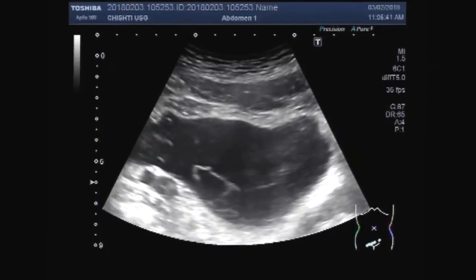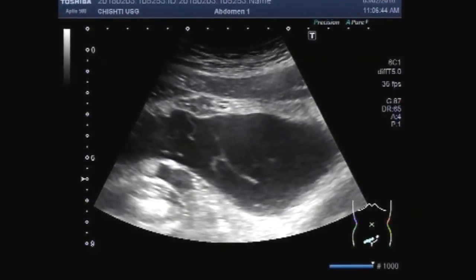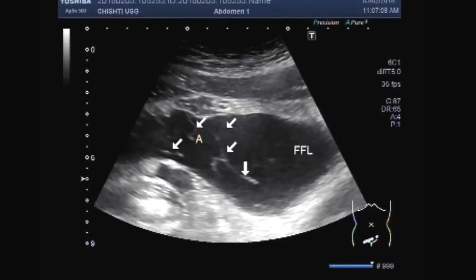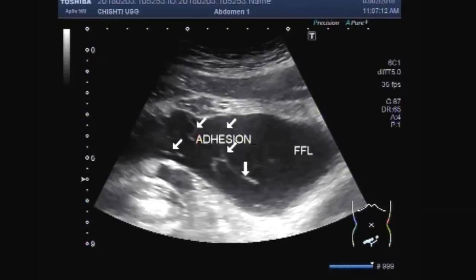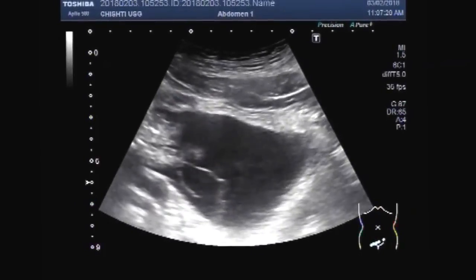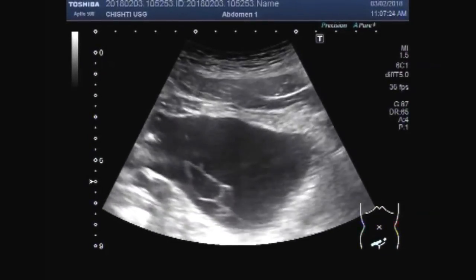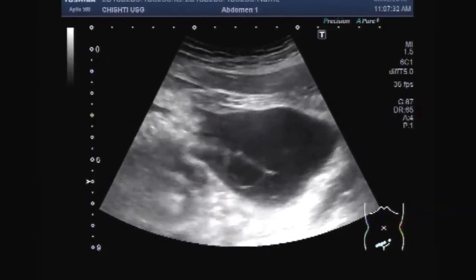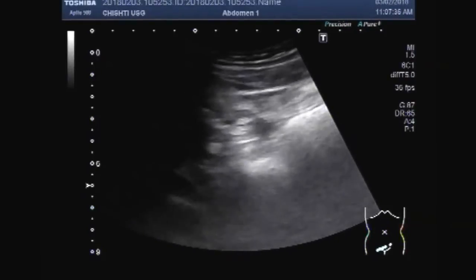Now you will see the ascitic fluid, and adhesions are seen to be floating in the ascitic fluid. The ascitic fluid is slightly turbid, having multiple internal echoes.